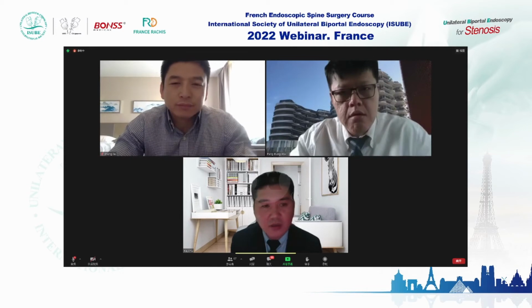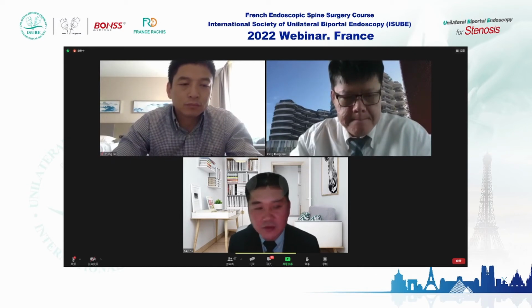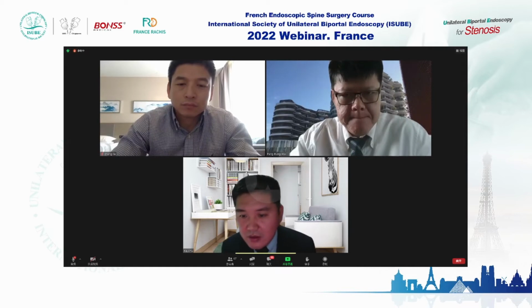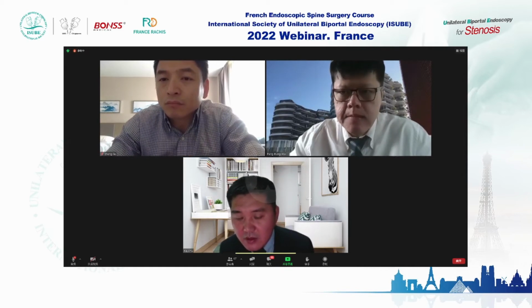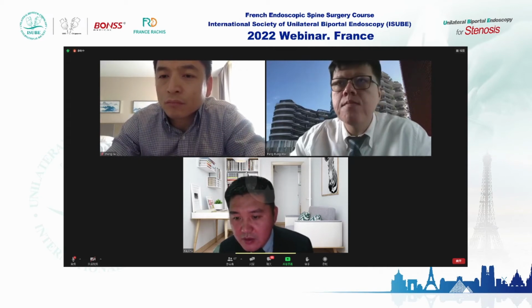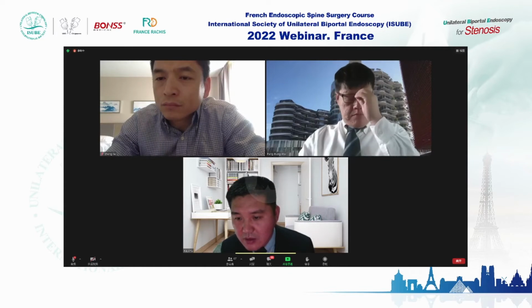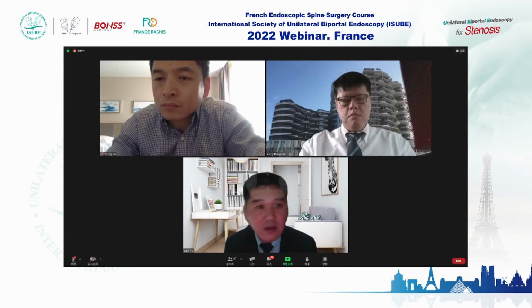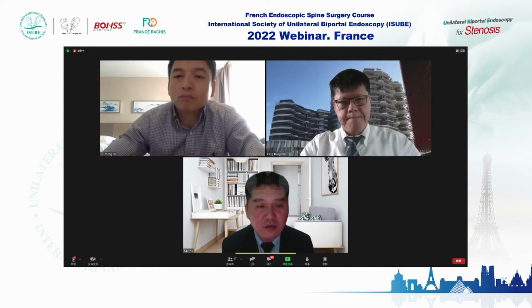So now we can also have some discussion. There's Dr. Om Patel. His question is, what are the commonly seen complications in UBE surgery while adapting to the UBE technique? Adhesions, epidural fibrosis, infections, residual back pain. So maybe Dr. Liu and Dr. Wu to answer this question.